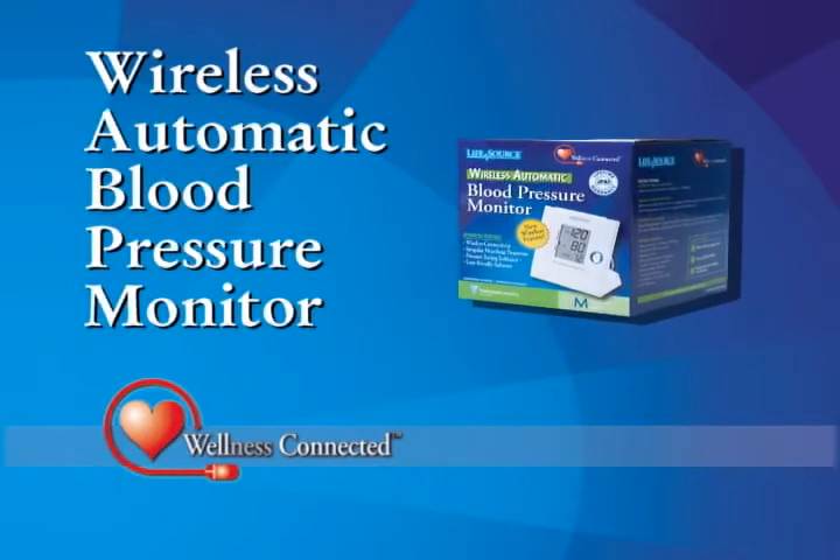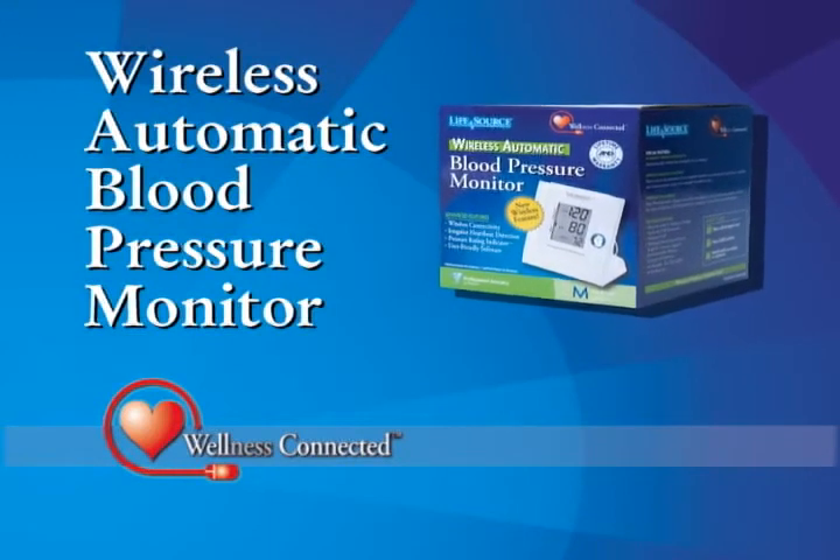The Wellness Connected Wireless Automatic Blood Pressure Monitor. Only from A&D Medical.